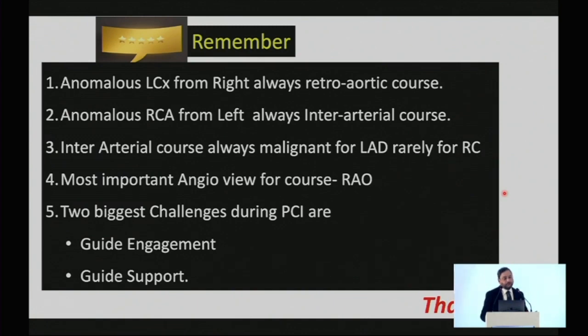The two biggest challenges we have to face during PCI are guide engagement and guide support, but with a few tips and tricks, play of hands, changing of adequate guide wires and guiding catheters, and manipulating your guide catheters well, you can overcome these challenges. I'm sorry for overstepping the time. Thank you, sir.